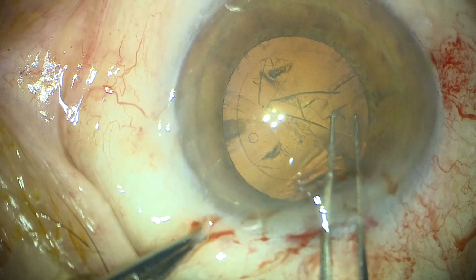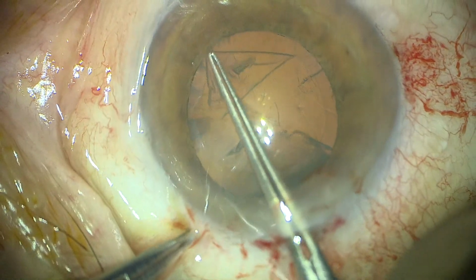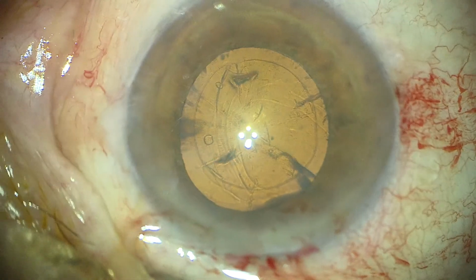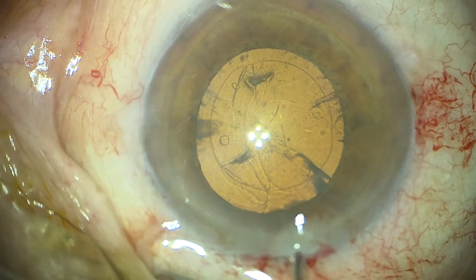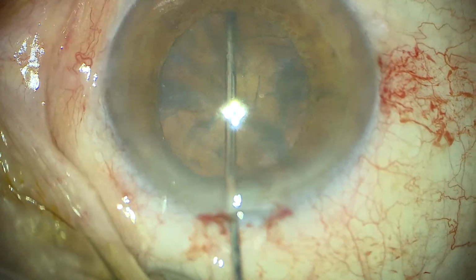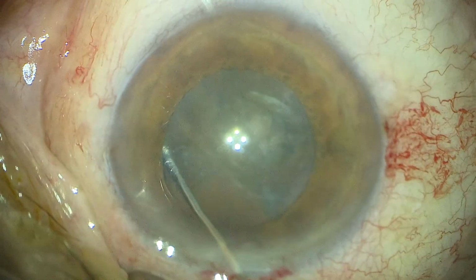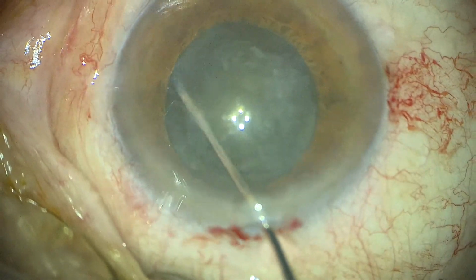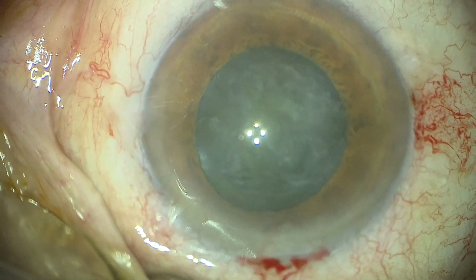The size of the capsulorhexis should be as big as possible to allow free mobilization of the nucleus without pulling the capsule with it. There is really no problem if we do the capsulorhexis through an area of pseudoexfoliation on the anterior capsule. This is not a weaker capsule. The weaker part is the zonules. And another potential problem, which we do not have here, is iris damage with iris that does not dilate.